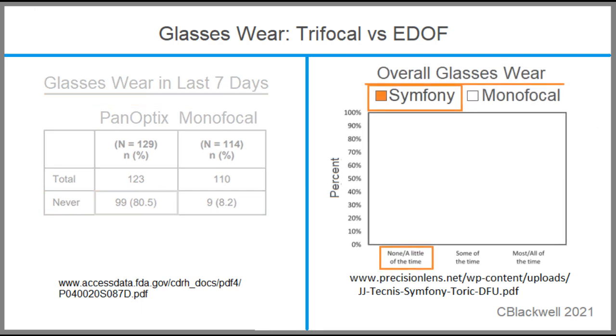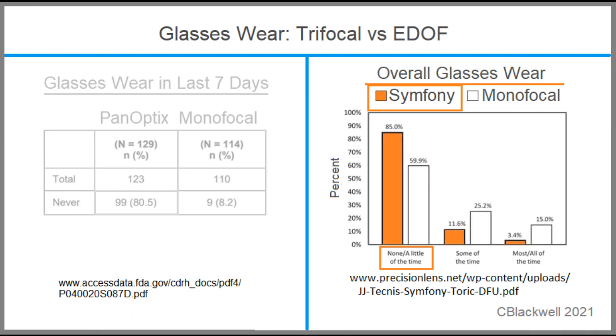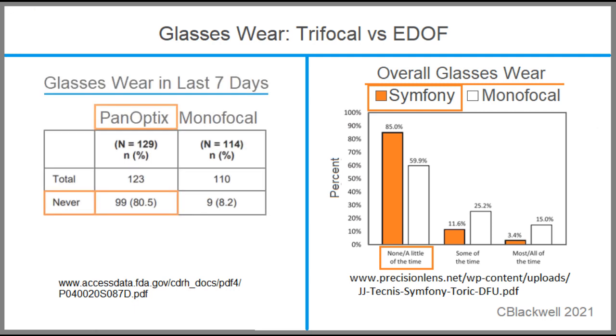For the Symfony EDOF lens, the question was how much they needed glasses. 85% reported the lowest category, they never wore or slightly needed glasses. Though interestingly, 60% of the monofocal subjects reported they never wore or slightly needed glasses. Nevertheless, the result is an impressive percentage for both.